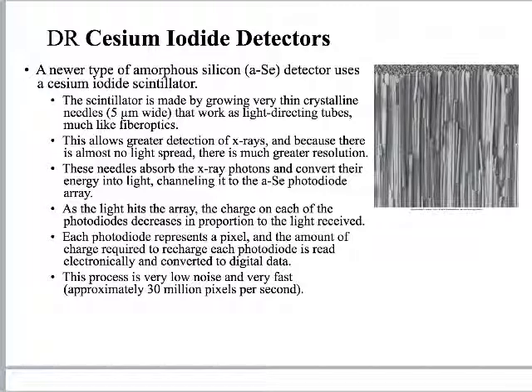Here's what those crystals look like, and this is one of the reasons why we use cesium iodide for indirect capture systems, is they get these really cool little light tunnel things, right? Like if you look at them, this is magnified under an electron microscope, this crystal, right? And each one of these channels is pretty darn straight, right? And we're talking about millions of these things, maybe even billions of these things covering a single readout plate, right? But definitely millions of them, perhaps over just a single transistor. But these work as light tunnels.